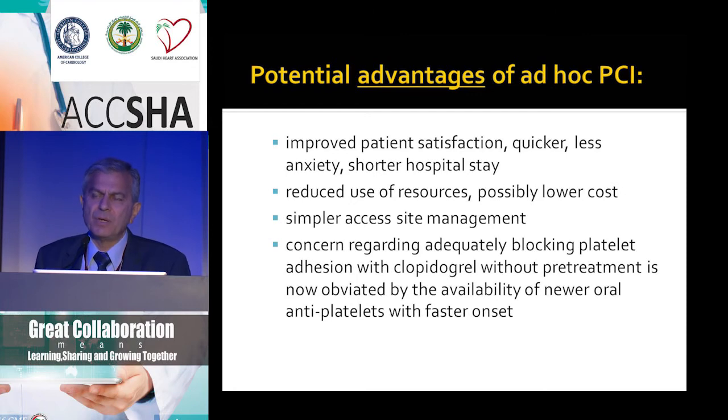In other words, we're cathing the patient, we don't know the anatomy, and then we find this ostial LAD involving the distal left main, very, very tortuous right with calcification, bifurcating PDA, and should we just move ahead or do, you know, one and stage the other?